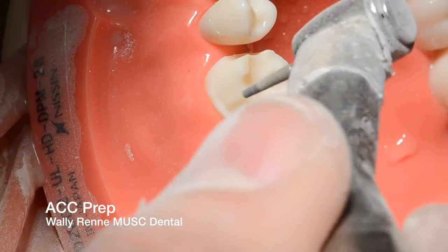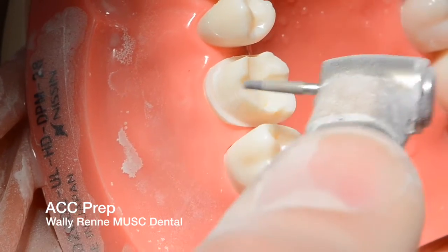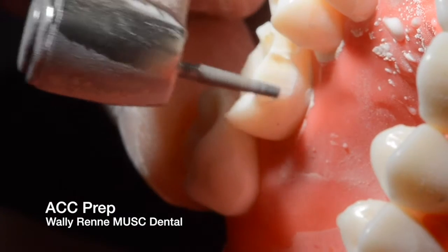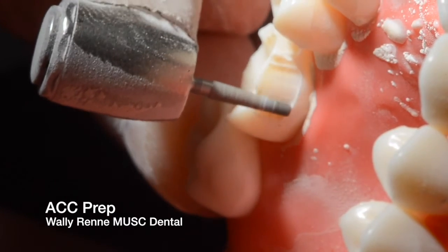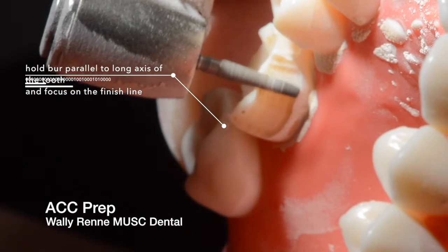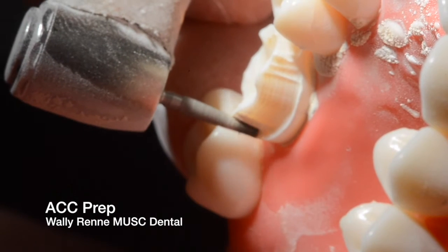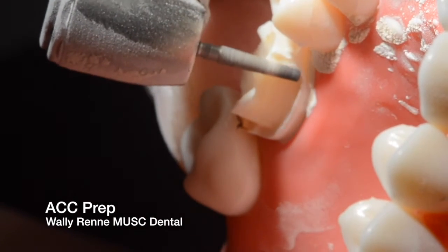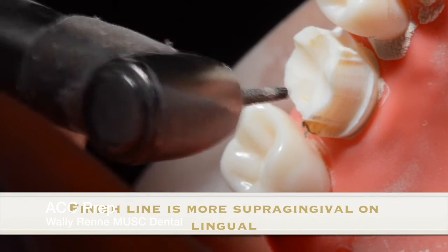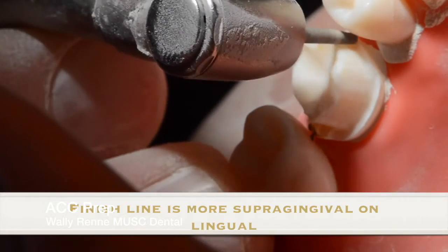Once you have your facial and interproximals, you're going to go back and smooth a little bit — just trying to get a uniform thickness to that finish line, making sure you're roughly around 0.8 millimeters. You're going to come lingual and blend that interproximal reduction with your lingual finish line. Lingually, I like to keep my finish line 2-3 millimeters supragingival just to preserve that enamel. Hold the bur parallel to the long axis of the tooth — that's really all I'm worried about, since axial reduction is a function of your finish line and taper. With the bur's built-in 6 degrees of taper, you don't have to worry about it.